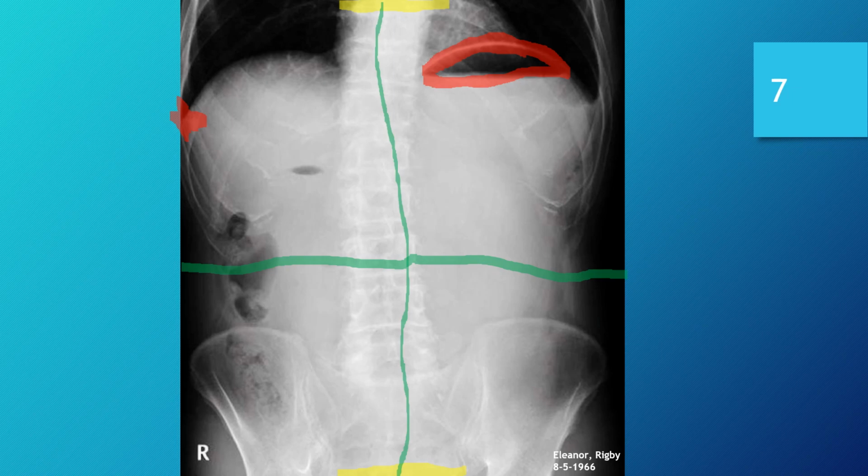Inferior superiorly, it looks to me as though they got the 2 inches above the iliac crest. Looks like they got that just dead on. I mean, it's really well positioned there as far as that's concerned. So just that slight issue with the mid-sagittal plane on the positioning.